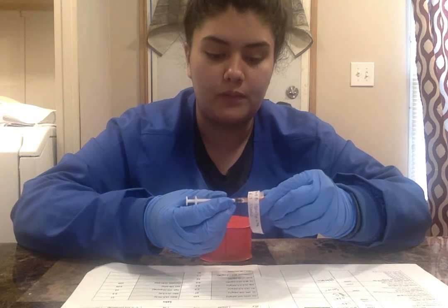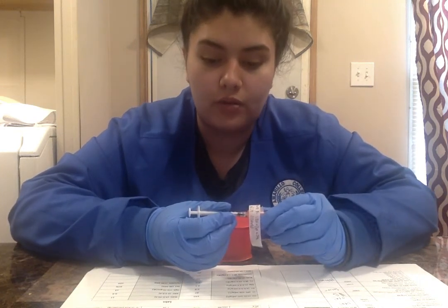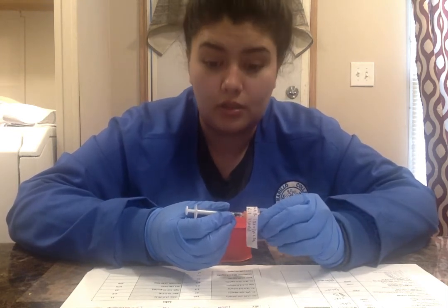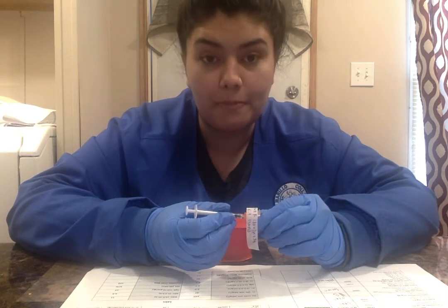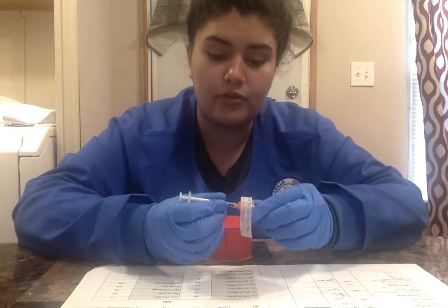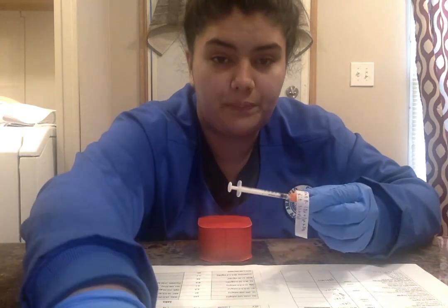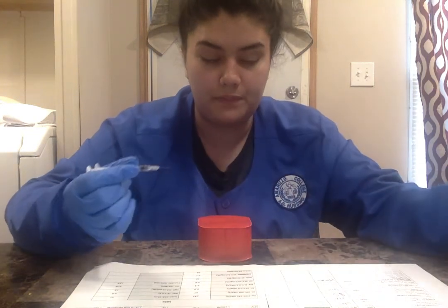Okay, so now insulin is to be given at a 45 to 90 degree angle, but Miss Kitlano here weighs 250 pounds, and for her only being 5'3", that means that she's pretty big. So I'm going to go ahead and give this at a 90 degree angle. If I was giving it at a 45 degree angle, it looks something like this, but I'm giving it at a 90 degree angle. So I'm going to go ahead and uncap my insulin.